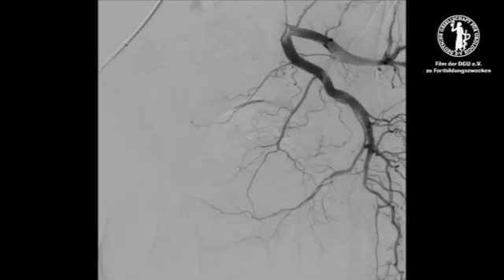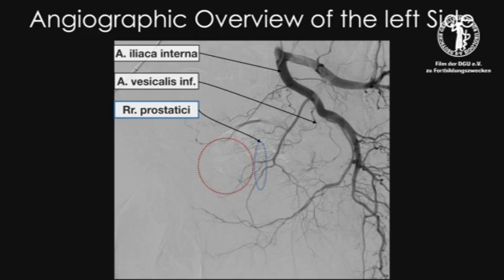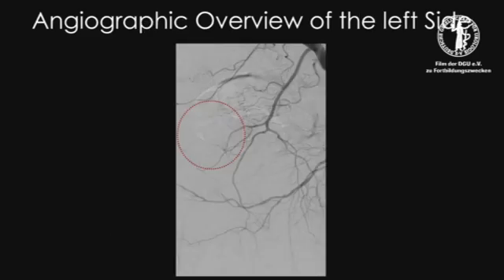Here we demonstrate the contrast between the expected theoretical vascular anatomy of the left side and the actual anatomy from the overview angiography. Highlighted in red is the tiny artery that showed to be the inferior vesical artery, and the circle shows the estimated location of the prostate.